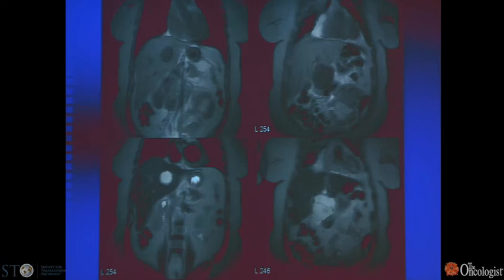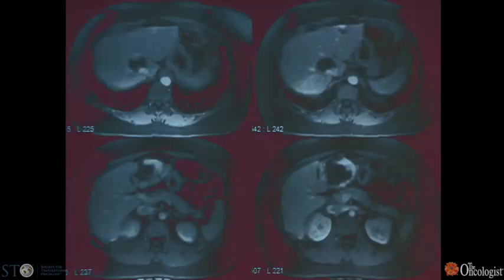That's not really the case anymore. The image resolution and the slice thickness are small enough on CT that one can make use of multiplanar reconstructions. Secondly, the pre-contrast imaging appearance coupled with the characteristic enhancement pattern show this to be a pedunculated hemangioma rather than a malignant tumor. I wanted to show at least one benign lesion in the oncology meeting, and so this was my opportunity.